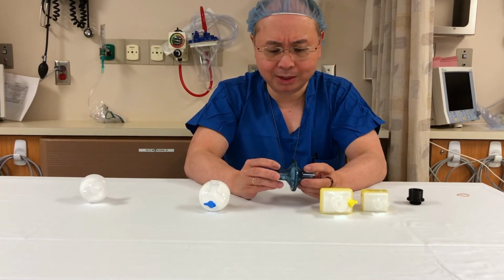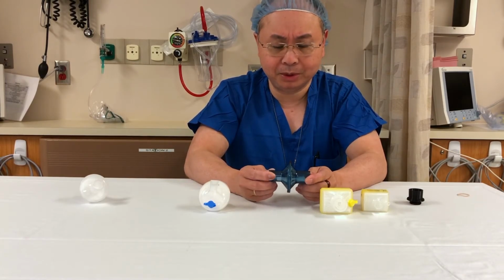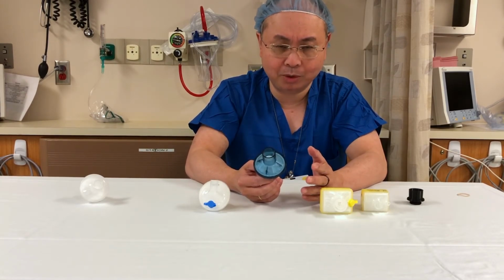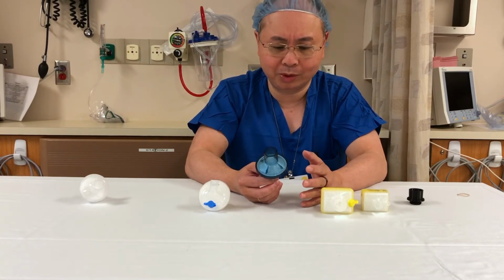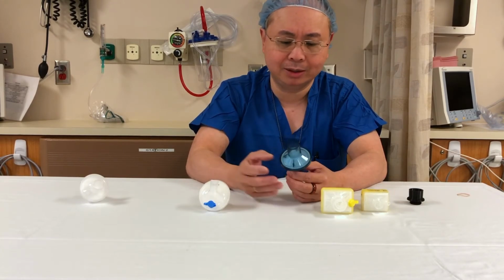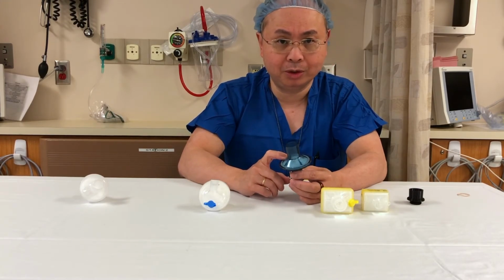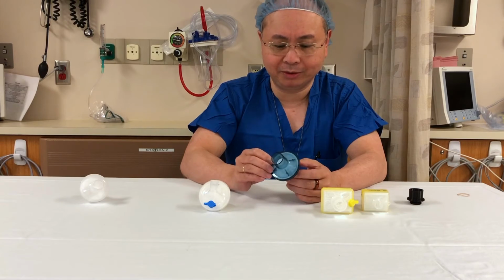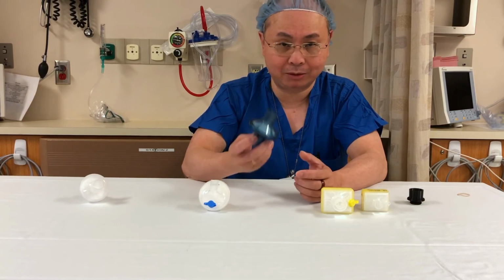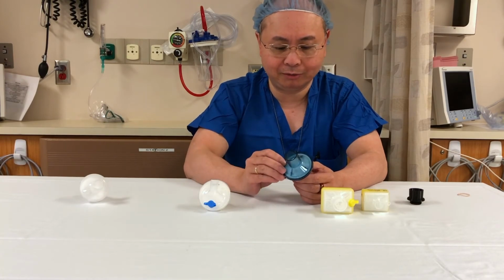So a responsible and reasonable conservative materials approach to using these filters would be to allow them somewhere between 24 to 48 hours of runtime, and there should not be too much difficulty with that unless you grossly soil the filter, or what would be very, very bad would be to get any alcohol into the filter element, because alcohol destroys the electrostatic capability of reducing viral load.